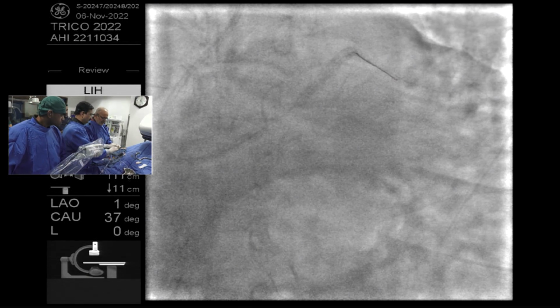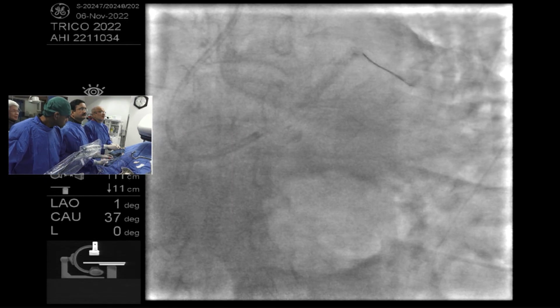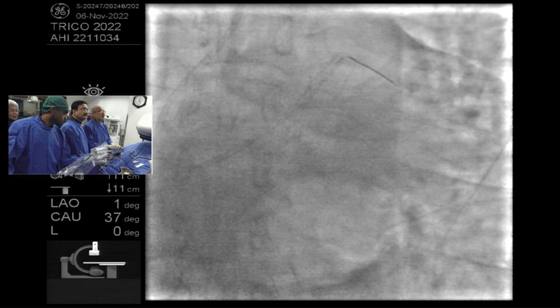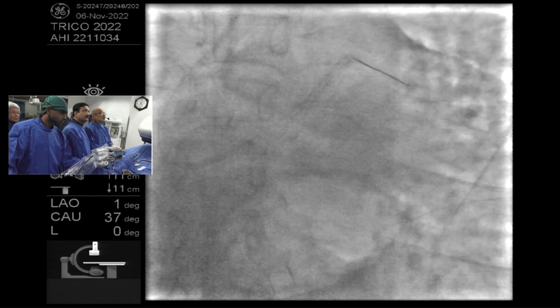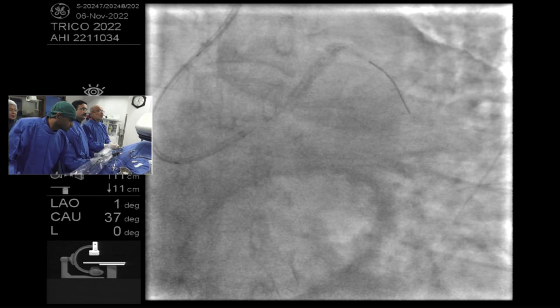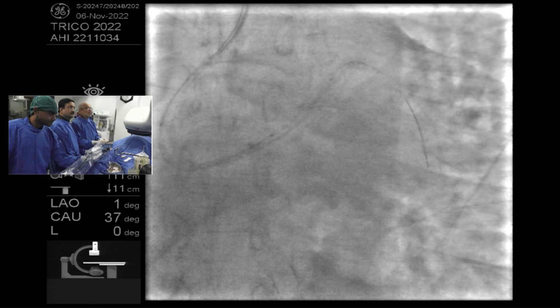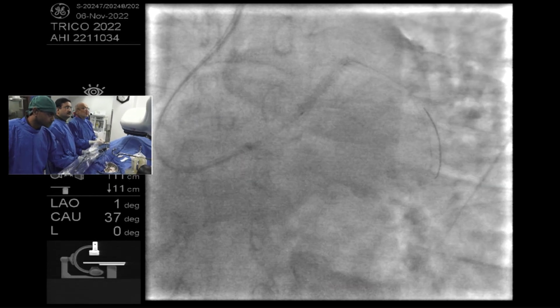I will go case by case, depending on the case. I think with a one stent strategy, KBI, even in the literature, is not really that beneficial. With a two stent strategy, it's probably a necessity. Right. So yeah, I think pretty much the consensus.